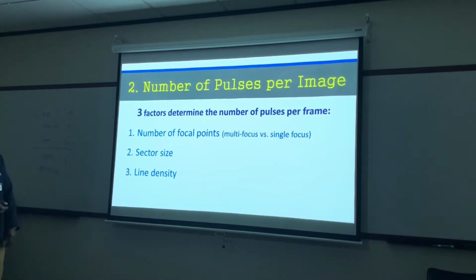Next thing is going to be sector size. You guys know how people change the sector size all the time, right? When people do the aorta, don't they change the sector size to real thin? When you do that, you're deep. Instead of our image now being this big, with all of these unnecessary scan lines, now it's this small, and all I need is this many scan lines.